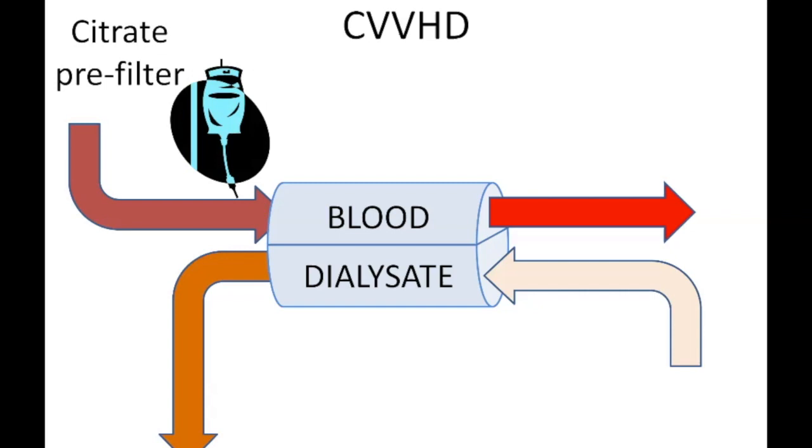As the citrate infuses into the blood, again, you ionize the sodium and the citrate, and the free citrate now binds free calcium in the blood, creating calcium citrate. As this calcium citrate accumulates in high concentration, any substance in high concentration in the blood will go down its concentration gradient into the dialysate. And so we're able to dialyze out the calcium citrate.